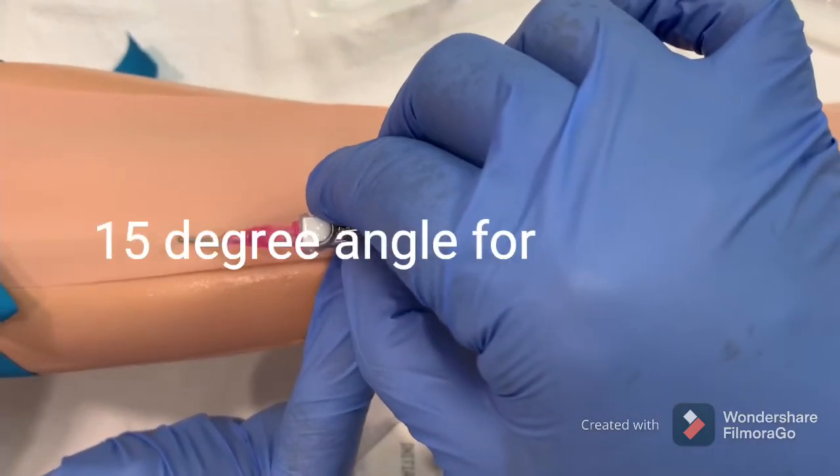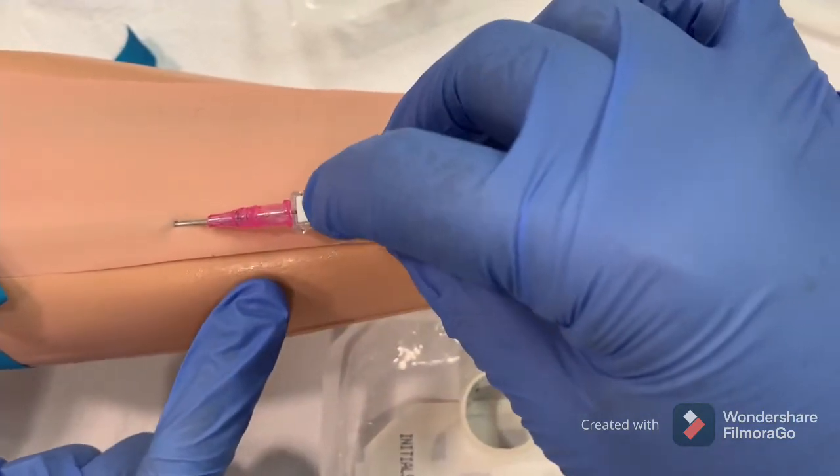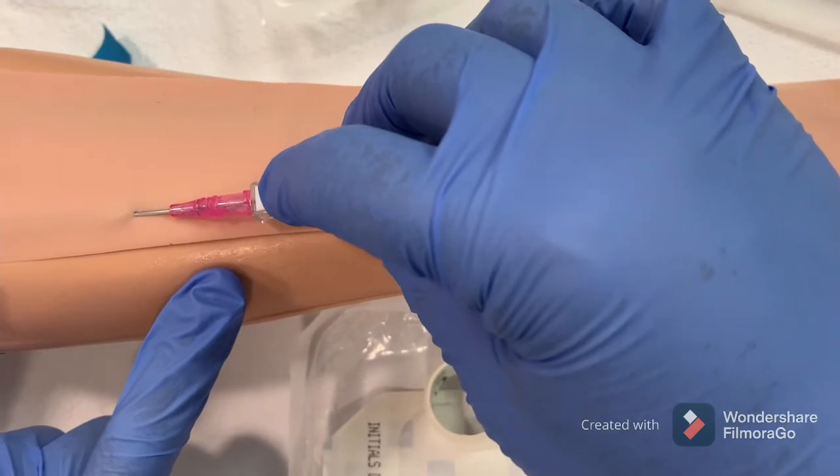Stretch the skin and once the tip of the needle is in, insert it forward. Once you touch the vein, you will see the blood backflow.